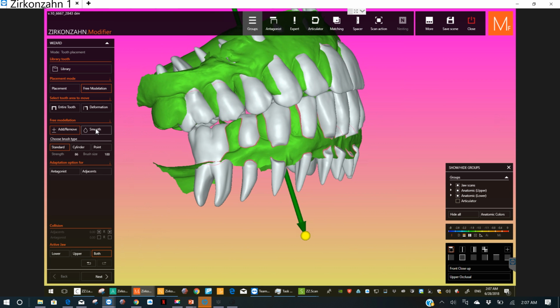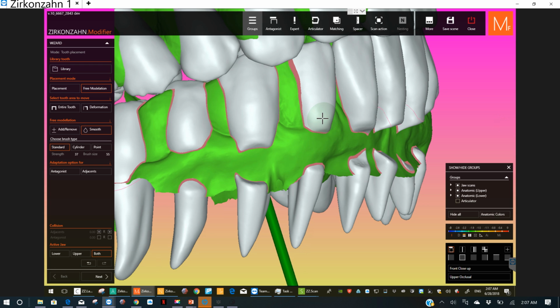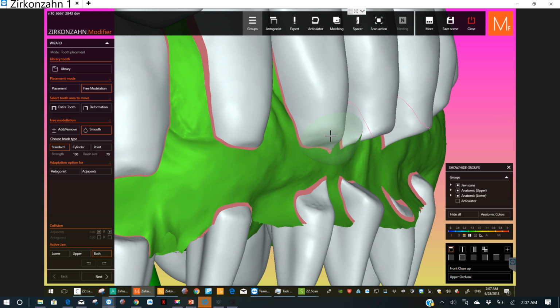So I might switch it to smooth mode, and it instantly redoes the strength and brush size again. And you can change the strength and brush size of your brush while you're working. You don't have to go over there to do it. So if I hold down Shift right now and roll the wheel, I'm changing my brush size. And if I hold down Control, I'm changing the strength. And you can tell that by how far the bubble shield is sticking out. You can see right there that a tall bubble means it's strong, and a flat bubble is kind of weak. So I like it strong, so I'm rolling the wheel up, and I'm going to blend this in so it doesn't bother their lip too much.